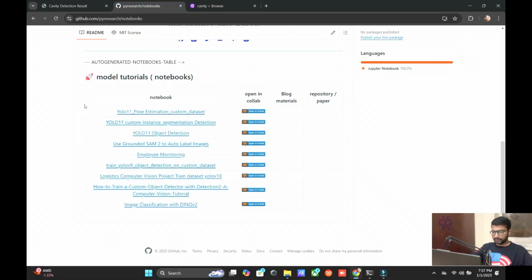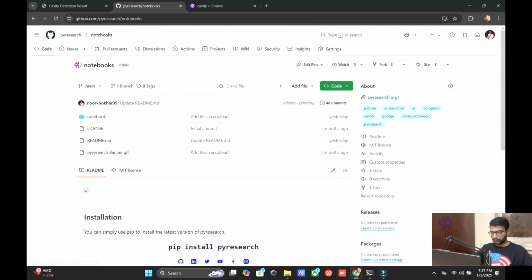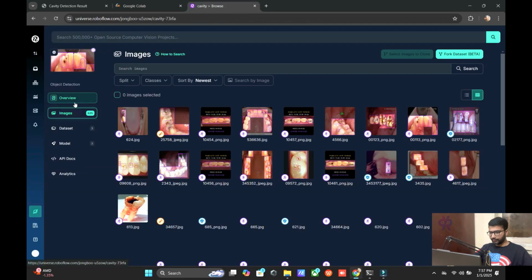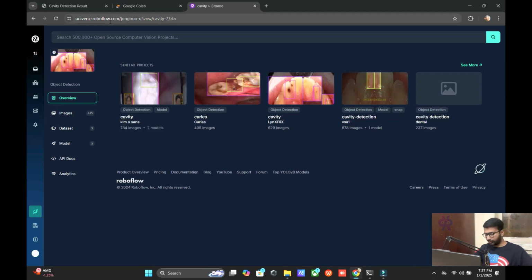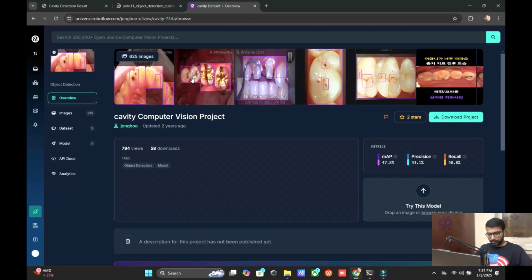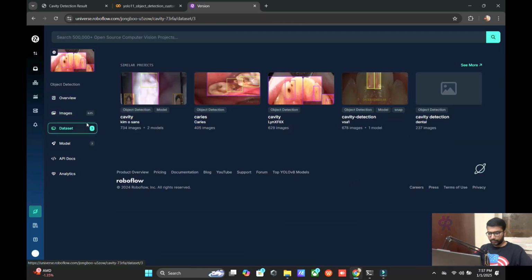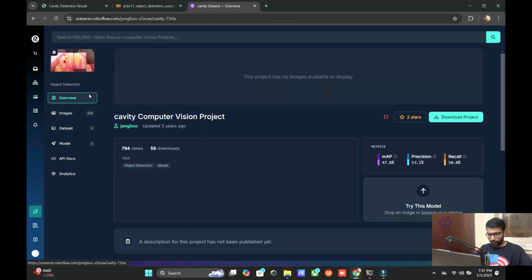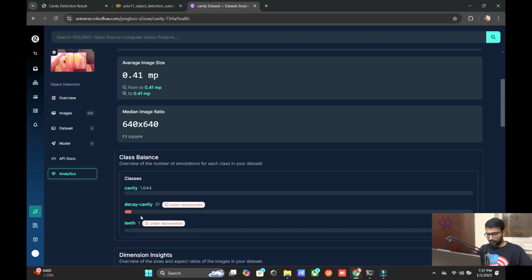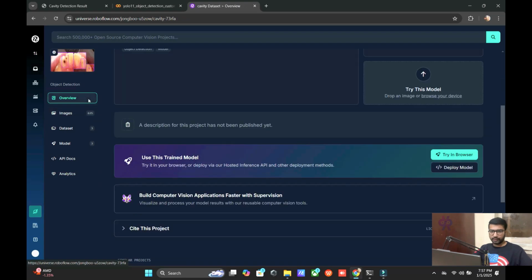We are going to go step by step. You can see after clicking the notebooks, here we use the YOLO11 object detection notebook, and you can see the overview of the dataset which we get from the RoboFlow site. It's very easy to integrate and download the dataset, and read the overview very carefully. We have the number of classes as 2. Let me show you. Okay, cavity and teeth. It's a small dataset, but we are targeting only the cavity side. The majority is our cavity detection.